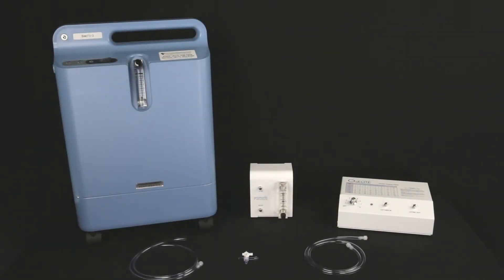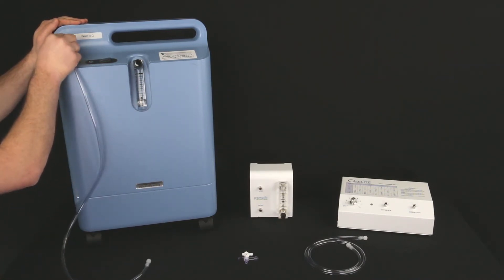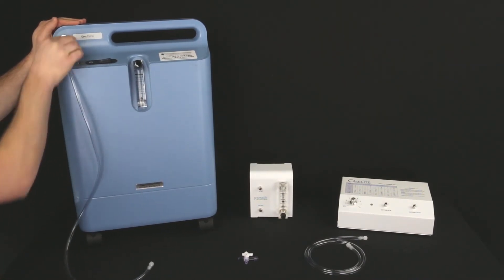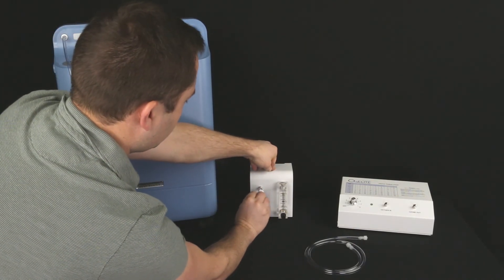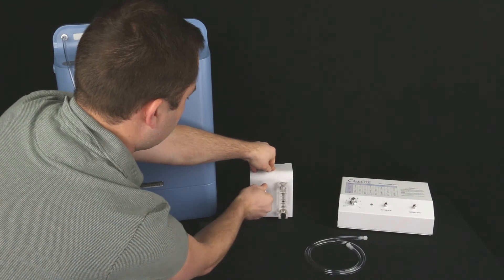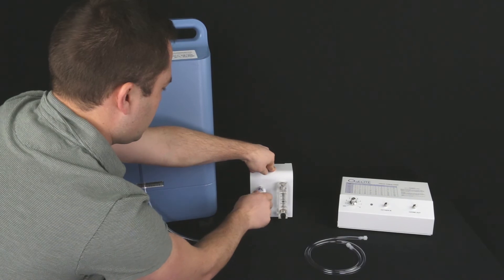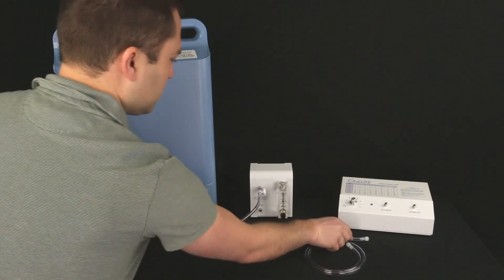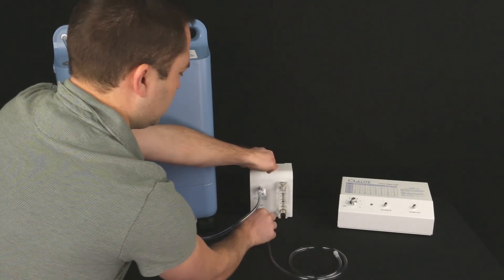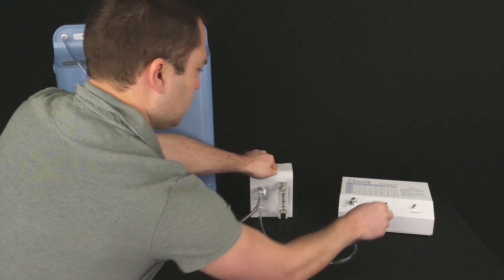Before you turn on your concentrator, you will need to connect the regulator. First, connect the segment of oxygen tubing with the open end to the oxygen concentrator. Next, connect the three-way stopcock to the oxygen in port on the low flow regulator. Then attach the other end of the oxygen tubing to the horizontal port on the stopcock. Now connect the other oxygen tubing segment to the oxygen out port on the flow regulator, then take the other end and connect it to the oxygen in port on the ozone generator.